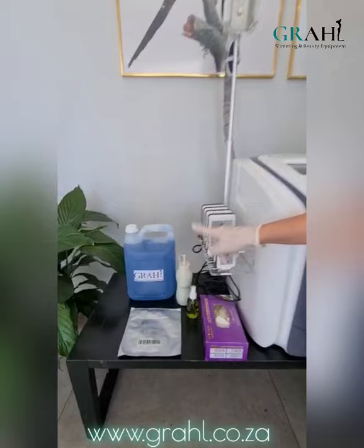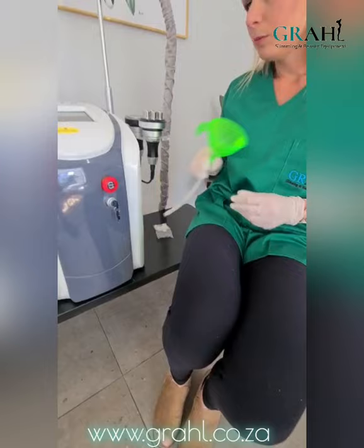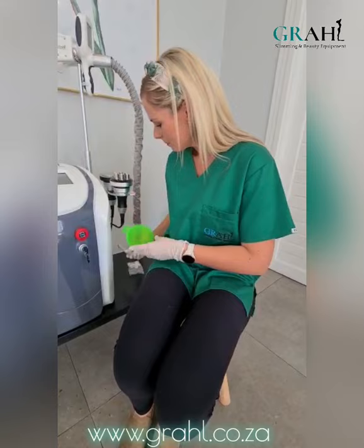When you receive your machine, you are going to receive a 5-litre ultrasound gel, antifreeze membrane gel pads, a funnel that will be attached to the back of your machine to fill it up with distilled water, and finally a few filters that are going to be inserted onto the fat freeze handles. You will also receive a few other goodies and odds and ends that are a little gift from Graal.